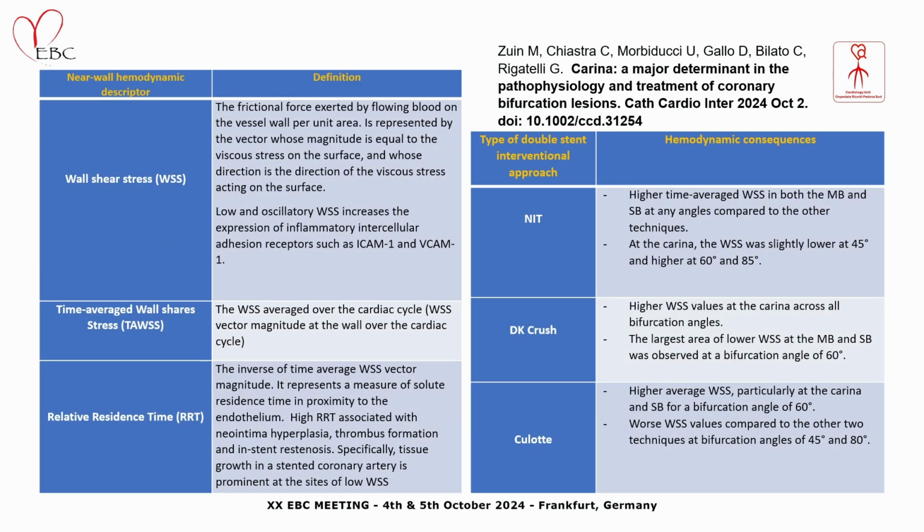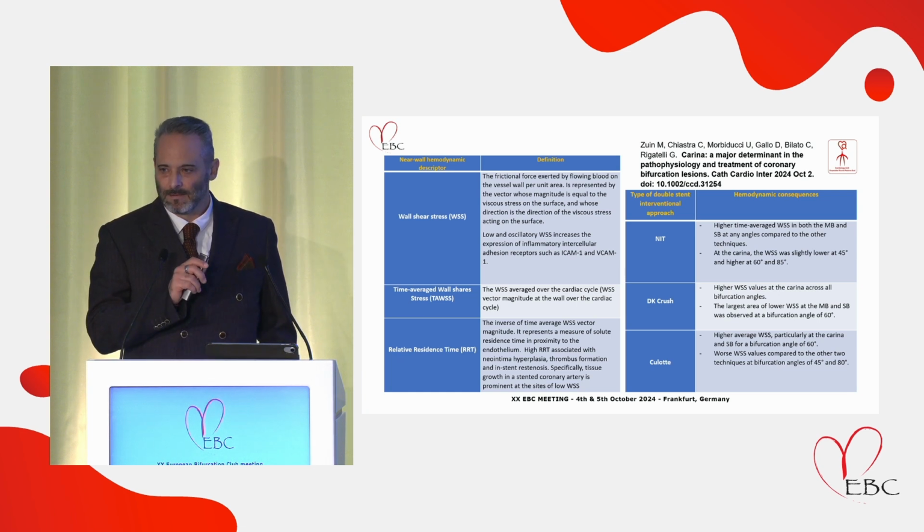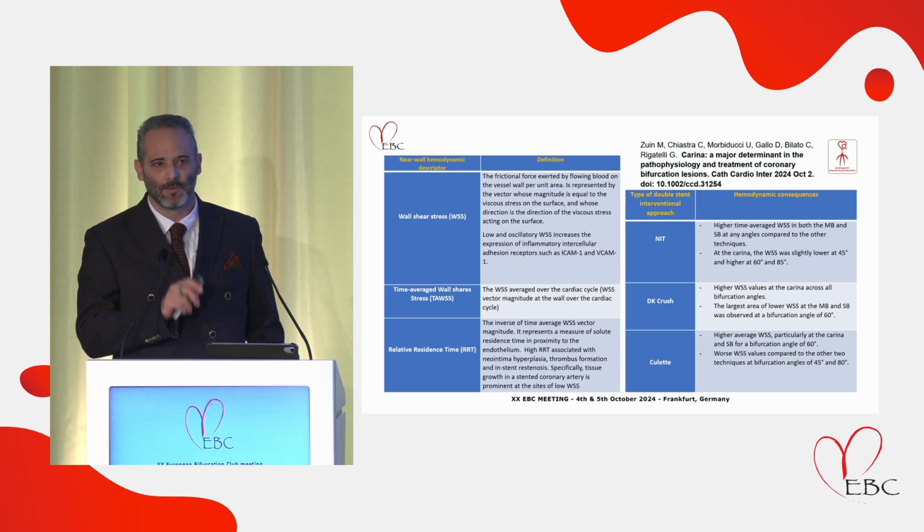There are a number of parameters in computational fluid dynamics that you can compute. We focus on the relative residence time, which is the inverse of the time-averaged wall shear stress vector magnitude, and it represents a measure of solute residence time in proximity to the endothelium. It means how much time the blood stays in a segment of the vessel after you put a stent, right?